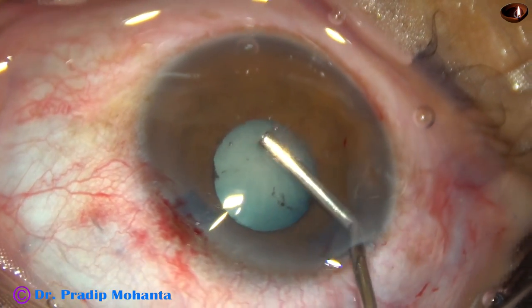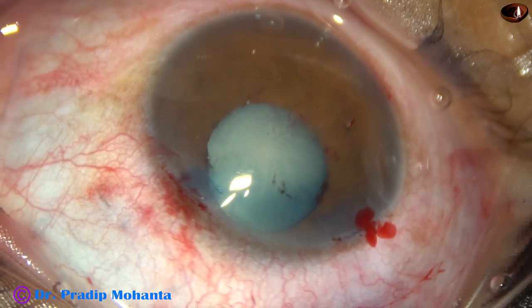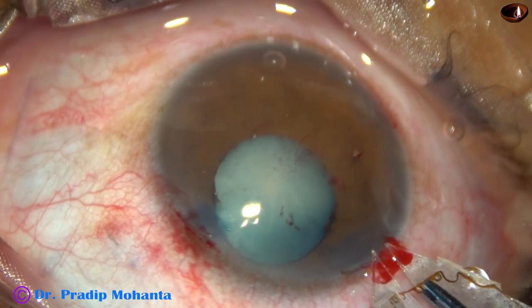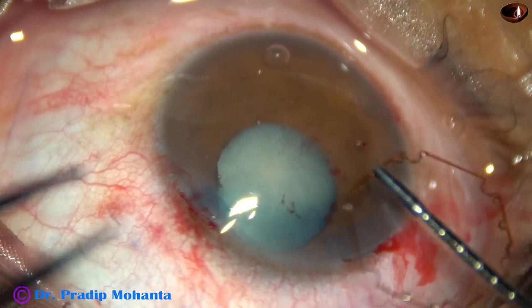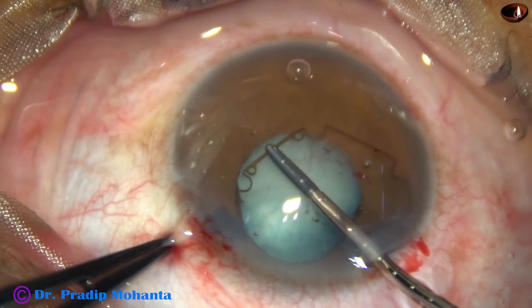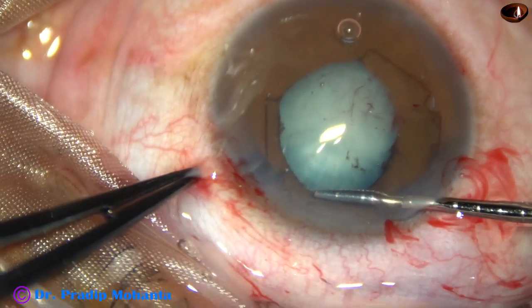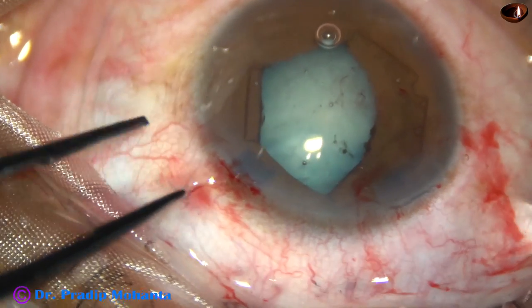This is a pupil expansion device invented by Dr. Suven Bhattacharji of India and it is hexagonal in shape. The pupil takes a beautiful hexagonal shape with this device. This is a single-plane device based on the concept that the iris can go above and below the device. It has notches and flanges. I hold one flange, take the device completely into the anterior chamber, and tuck the leading flange centered at 5 o'clock.